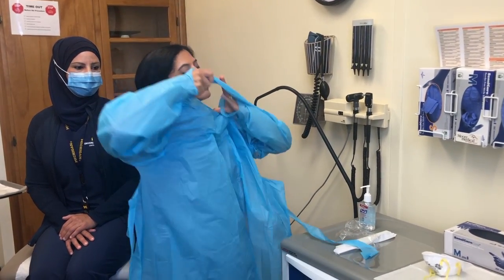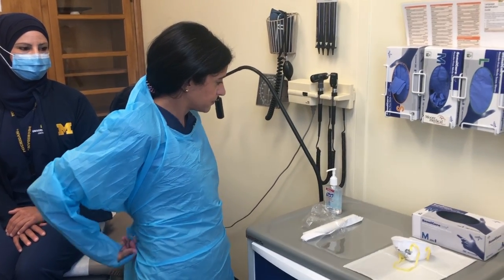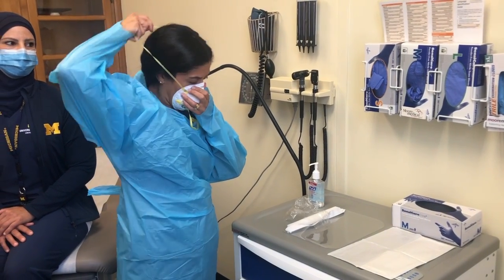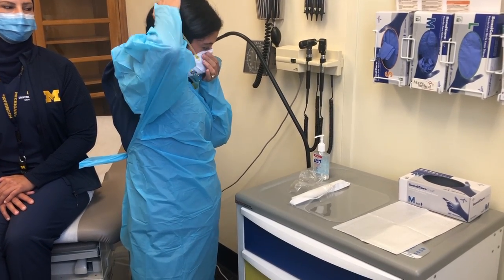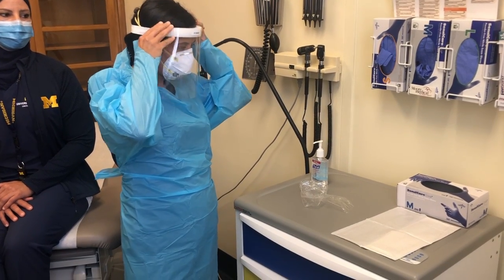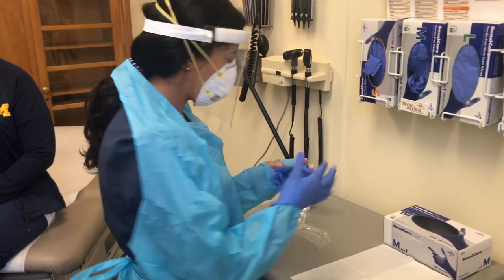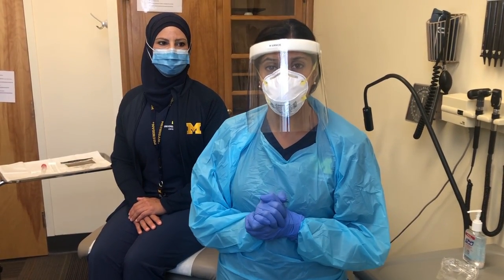So next, I'm going to put on my gown. You want to put your thumbs through the holes and your head through the larger hole. Loosely secure this in the back. So next I'm going to put on my mask. Again, I'm going to use an N95 here considering that my patient is symptomatic. Next is my face shield. And last I'll put on my gloves. Okay, now I have all my PPE on and we're ready to test.